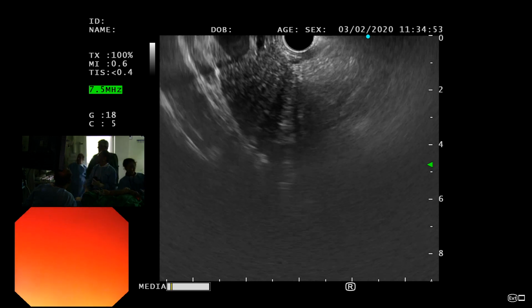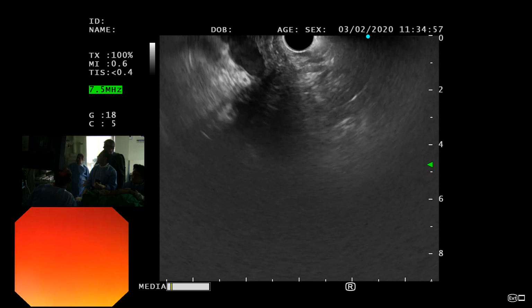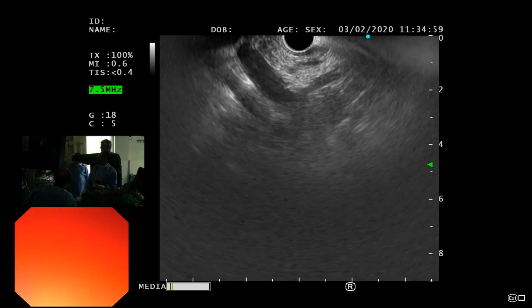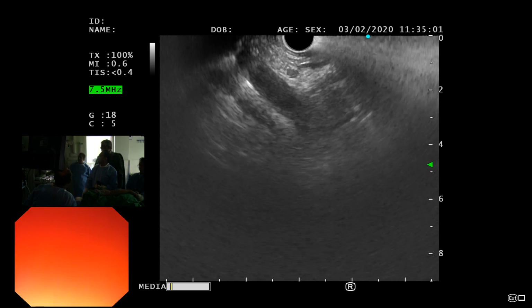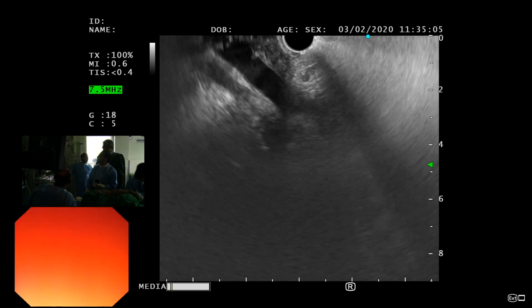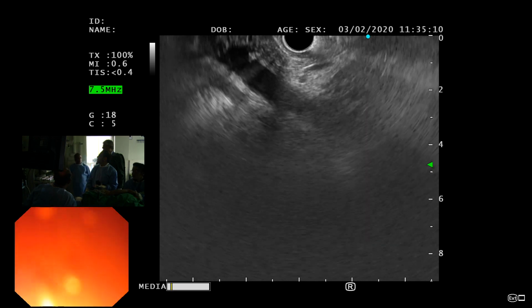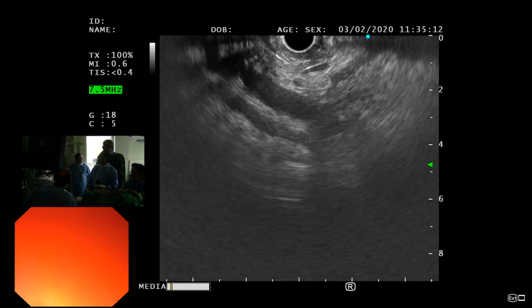अब आप एंटी क्लॉक करो जरा. आपने पहले क्लॉक किया था. देखो होता क्या है. So your portal vein is coming down. Just pull back your scope a gentle, just a little, right? Okay, keep coming a little bit. Okay, now clockwise.